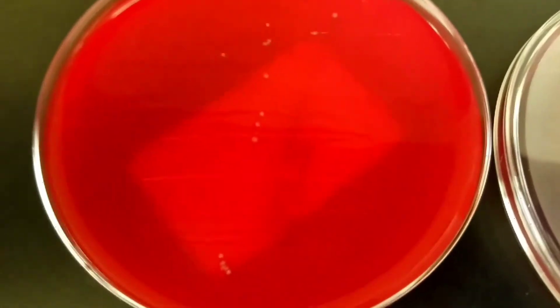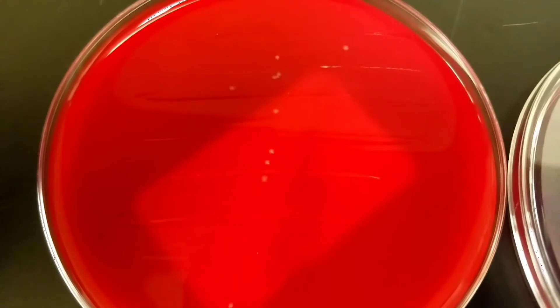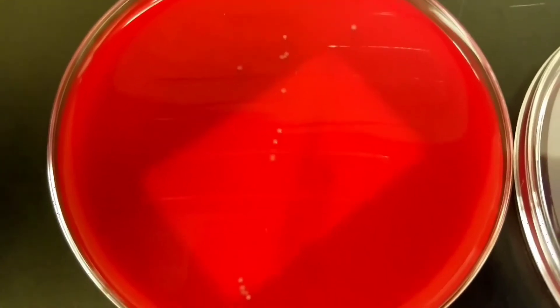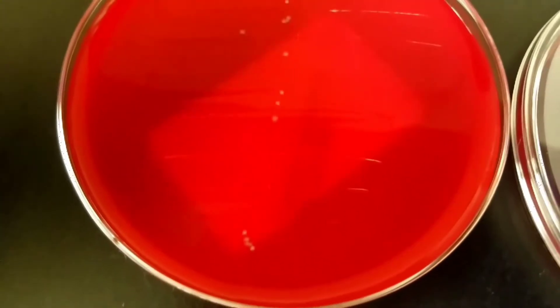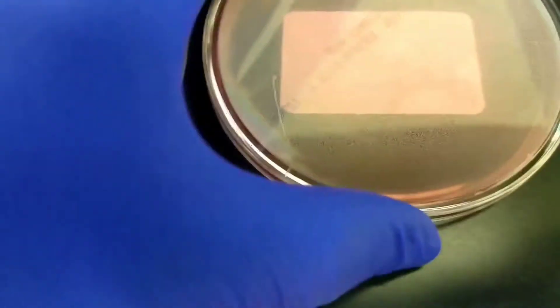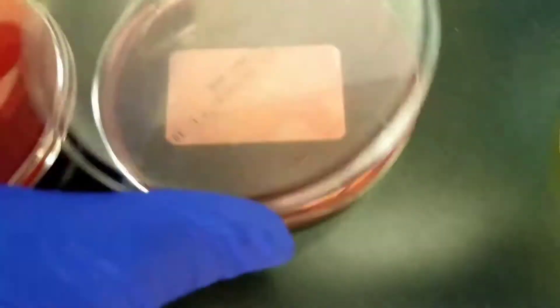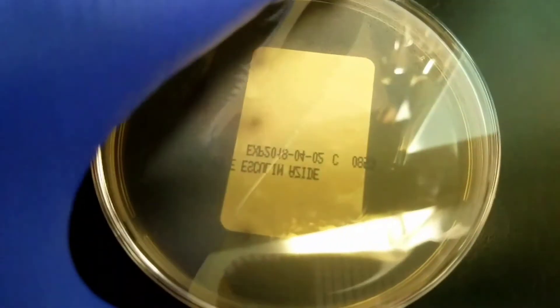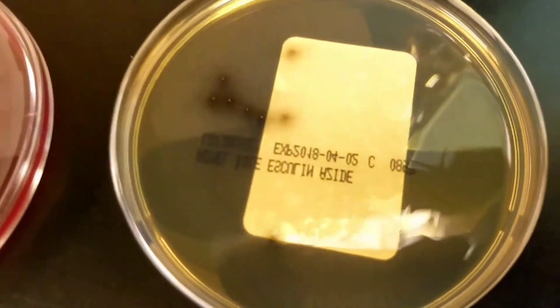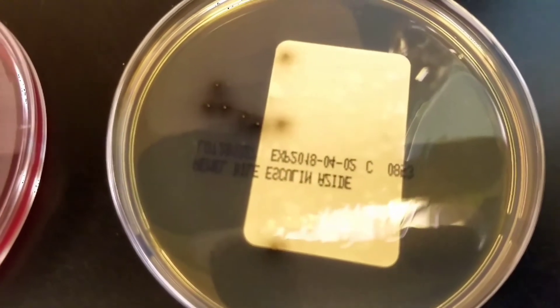On this next urine culture we have some very very tiny colonies, not very many — let's see, one, two, three... maybe fifteen total. None on the MacConkey. The ones growing on the blood agar look like the same type growing on the BEA, so it's probably an Enterococcus.